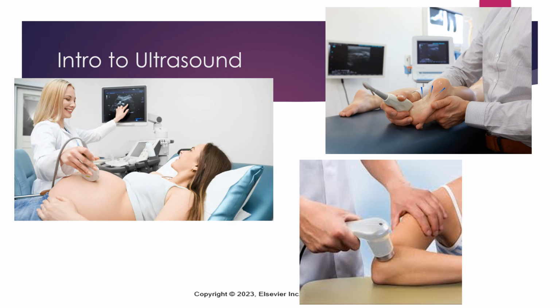So obviously, looking at a baby in utero is something that you may be familiar with. On the right-hand side, the top corner there, we see that this physical therapist has dry needled this plantar surface of the foot. Maybe this patient has something like plantar fasciitis, but what's likely happening here, and this is becoming a little more common, at least in the state of New Mexico, PTs are able to use this diagnostic or imaging ultrasound to place these needles so that they have more specific placements and they're not just guessing based on anatomy labs that they've performed many years ago. So we can actually help guide those needles into the correct places where they need to be.